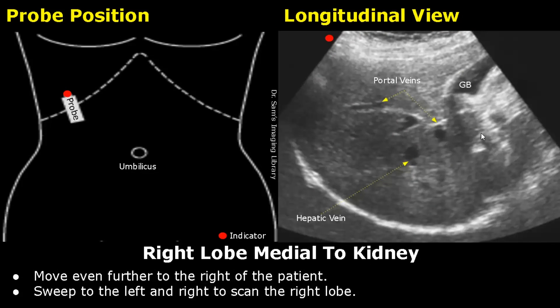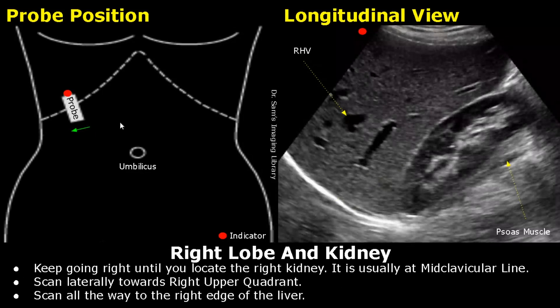Move even further to the right side of the patient while keeping the probe slightly rotated anticlockwise and you will see more of the right lobe of the liver. Sweep left and right to scan the right lobe completely. You will see the gallbladder, portal veins, and the hepatic veins.